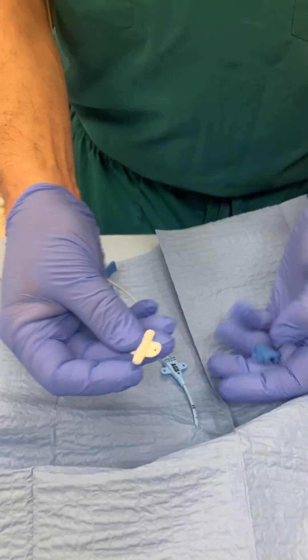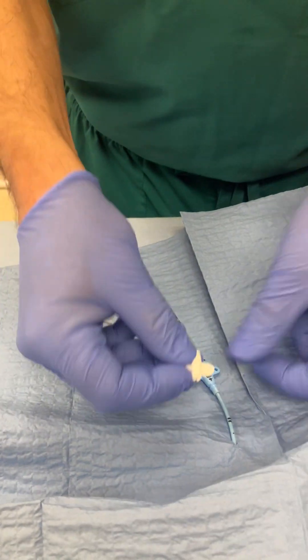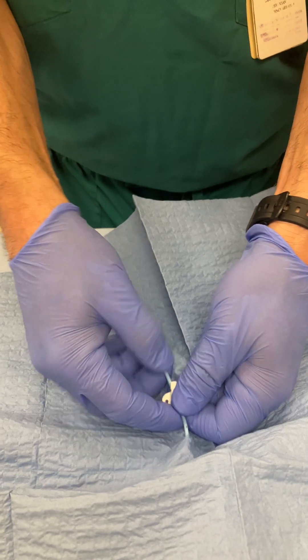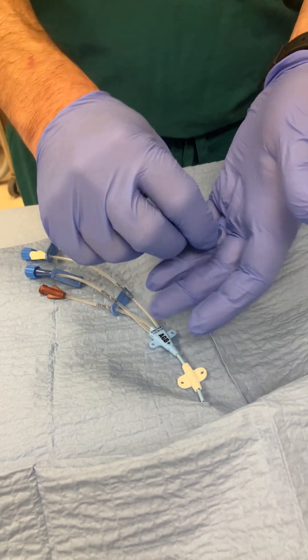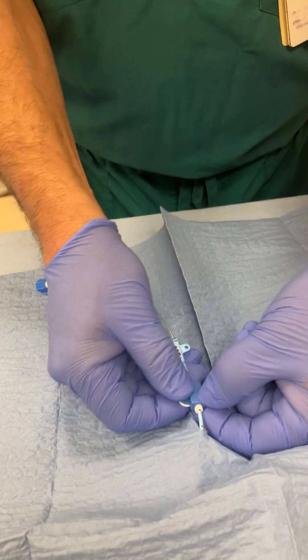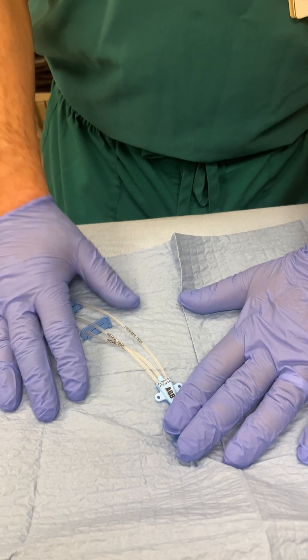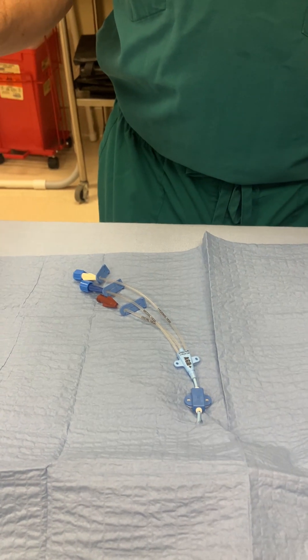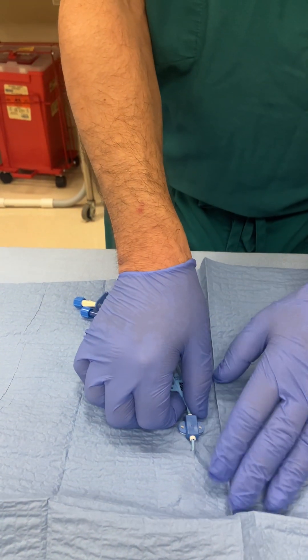These are the additional anchors. This is a soft anchor and this is hard plastic. You get the soft one and put it below the other anchors that are built in, then put the blue one on top of the white one, and then suture those in place. Now we have placed our central line. I'm going to show you next the variation.